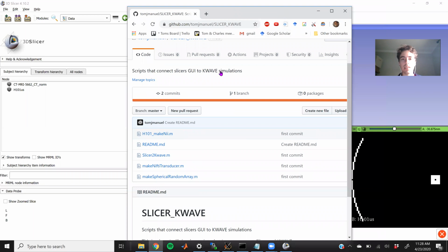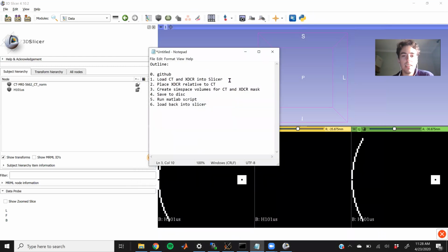But the main perk, I think, is that if you want to use this approach and merge it with the optical tracking methods that you develop, then you could create a new branch off of this repository and edit my scripts and add your own scripts. And then, I'll be developing these independently, but once they're both in a stable position, we can merge them using the GitHub tools. So that would be ideal. Sounds challenging, but I think that's how it's supposed to be done in theory. So, okay, let's do this.